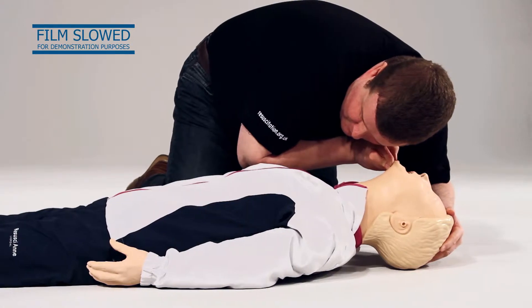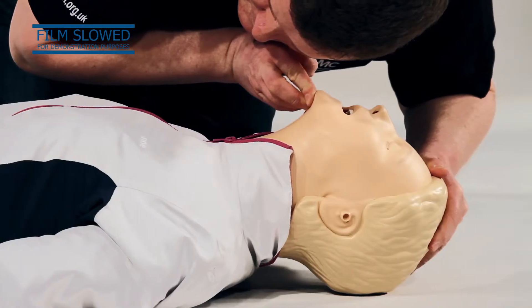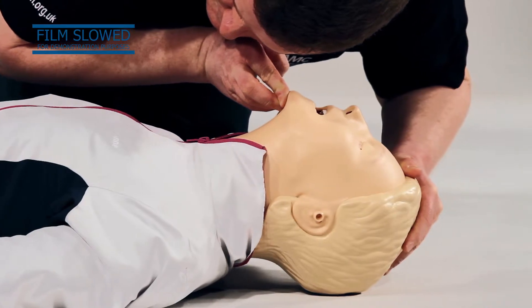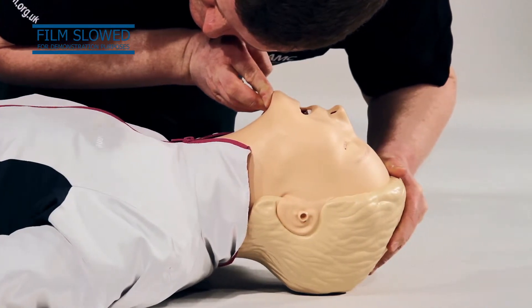Whilst holding the airway open, place your head next to the casualty's face and look, listen, and feel for normal breathing for up to 10 seconds.